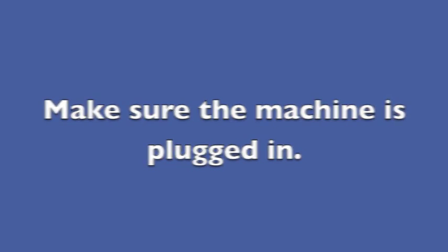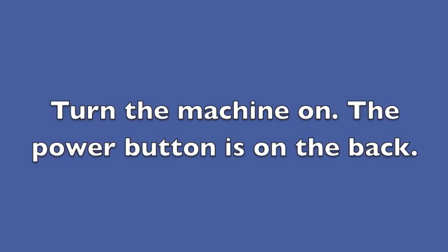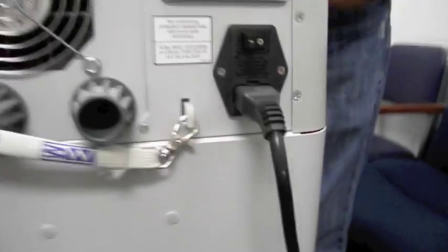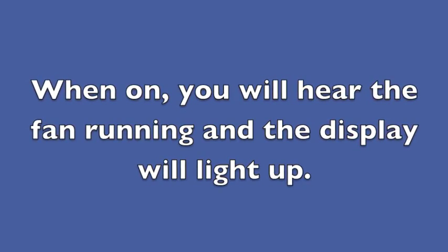Make sure the machine is plugged in, then turn the machine on. The power button is on the back. When on, you will hear the fan running and the display will light up.